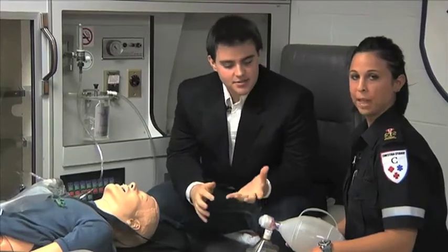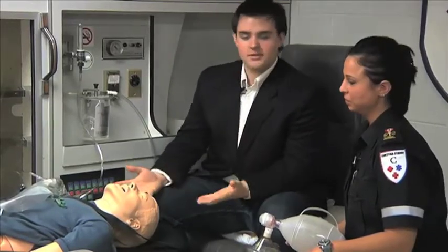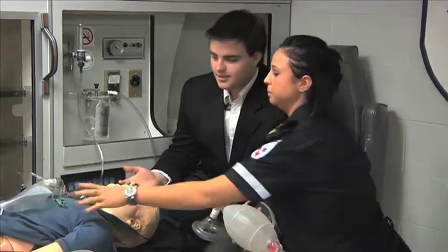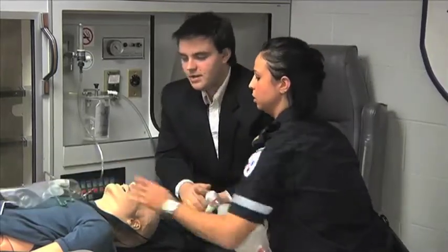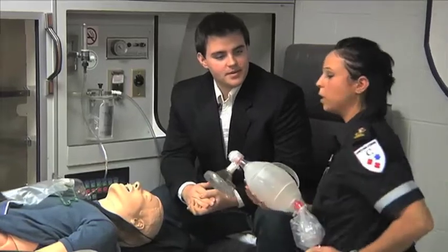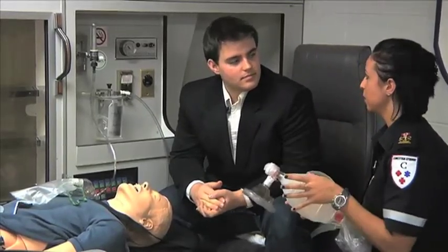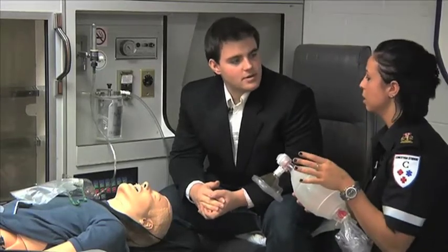We are here with Michelle, and she is a student of the paramedic program. What year are you in, Michelle? I'm in first year. What are you going to be demonstrating to me on this dummy here? Today I'm going to demonstrate when a patient has oxygen on, and we need to use what we call a bag valve mask. This allows us to help ventilate them because they're unable to get oxygen in on their own.